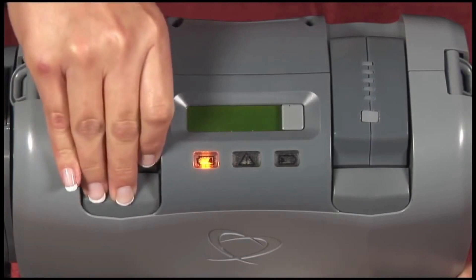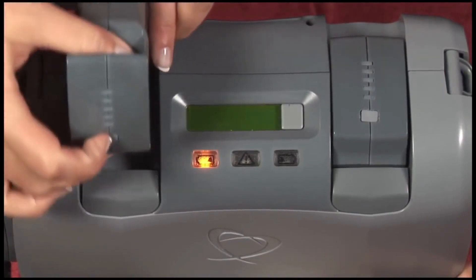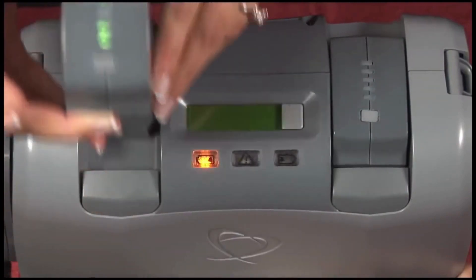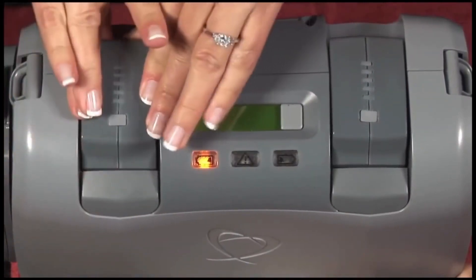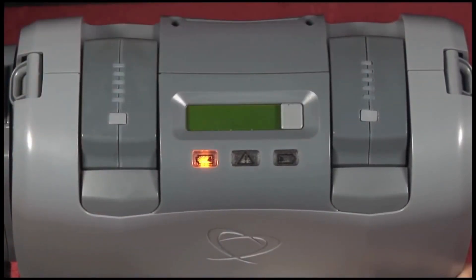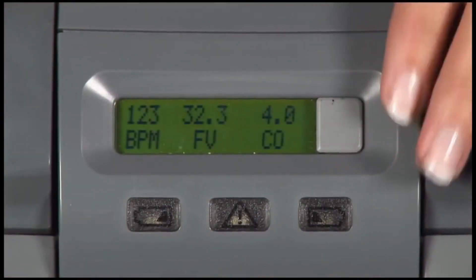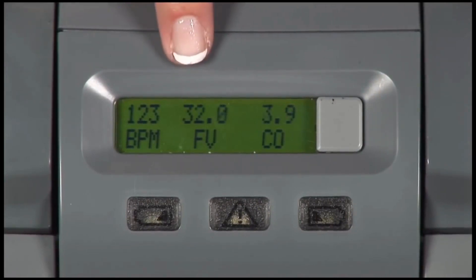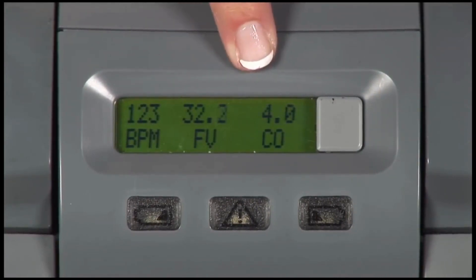A battery alert is also intended to sound when one of the two removable batteries drops below 35% charge. The driver is designed to continue to alarm until charged batteries are inserted into the driver. By pressing the display button, patients can read their beats per minute, their fill volume, and their cardiac output.